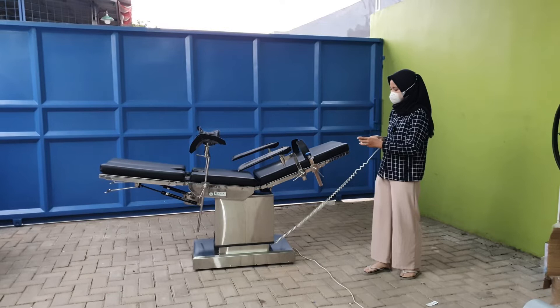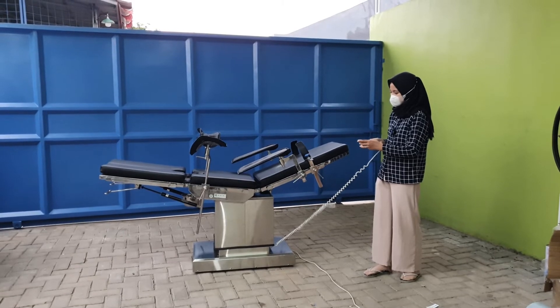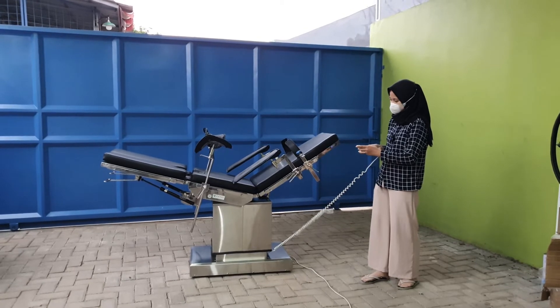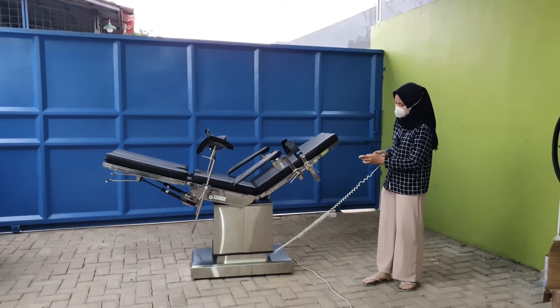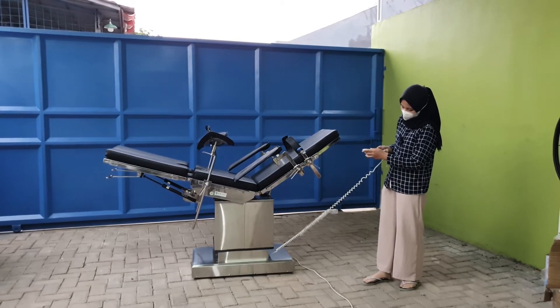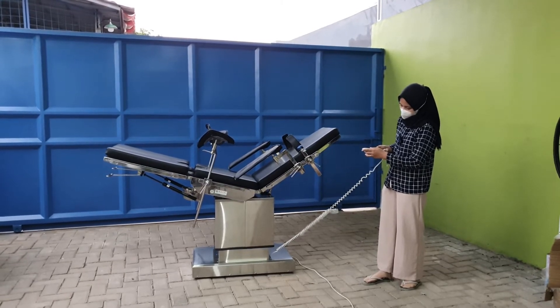Dan yang ketiga yaitu menaikkan bagian punggung dan bokong secara bersamaan. Dan posisinya juga bisa diatur menjadi naik ataupun turun.